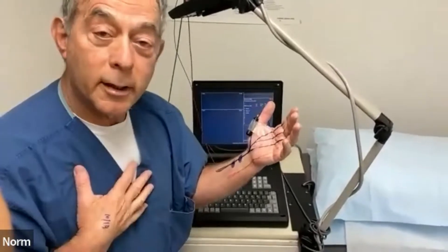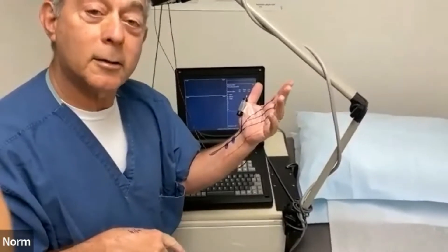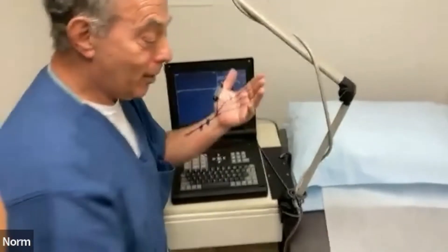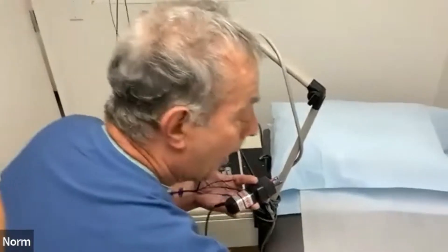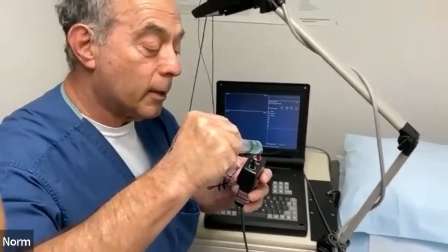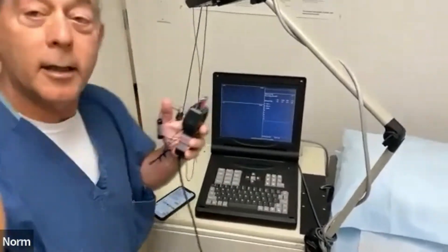I personally have been experiencing some numbing and tingling in my hand, so I'm wondering if I might have carpal tunnel today — and that's something we're all going to learn together. I'm about to now demonstrate this. I'm going to take my stimulating electrode and add a little gel to improve the conductivity of the nerve so I don't have to stimulate my wrist excessively, because it hurts a little bit.